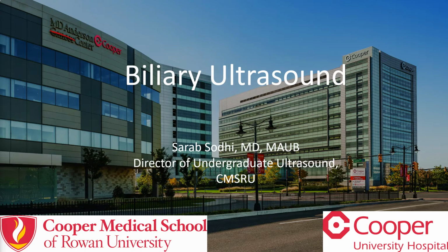Hi, we're going to talk today about biliary ultrasound. So, a brief introduction to what we're doing and why we're doing it. As far as patients who present with abdominal pain, one of the more common diagnoses we think about, especially with patients with right upper quadrant pain, is whether or not they may have gallstones or a gallbladder infection.